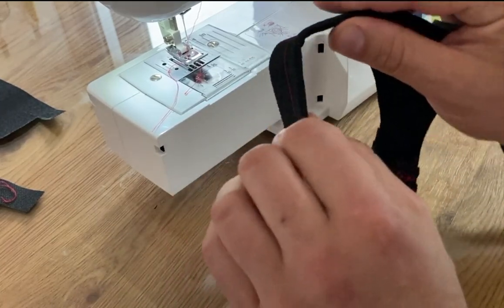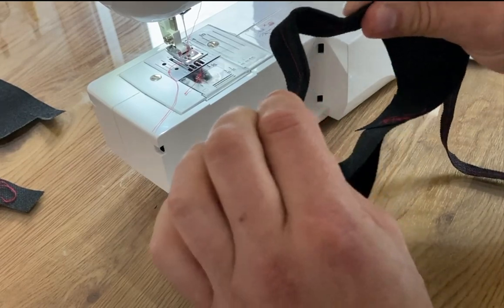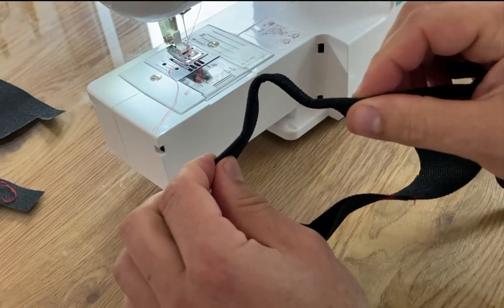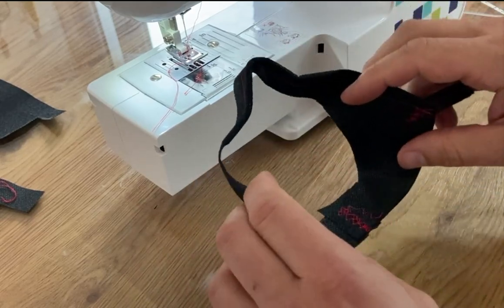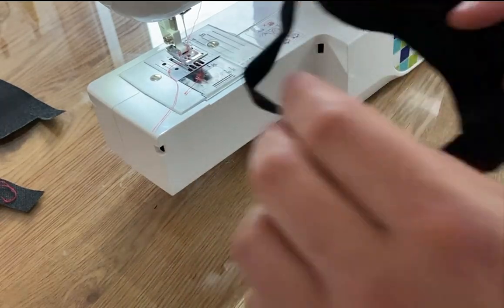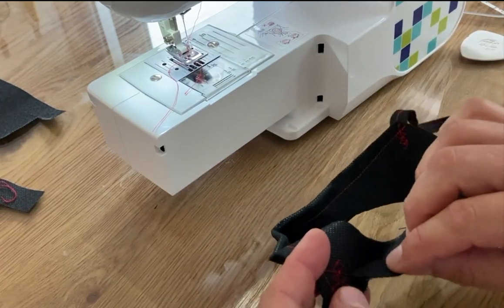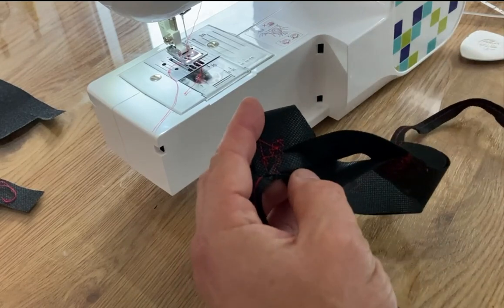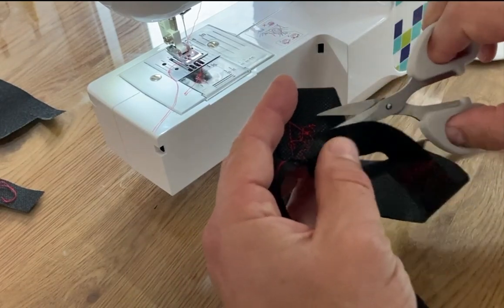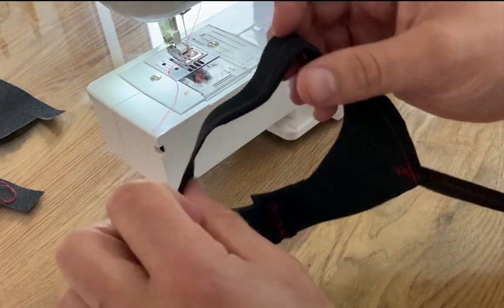You would make a horseshoe shape-ish, you know, that was about 10 centimeters for your nose shape. You put your surgical mask on first, then you put this on your face, then you put your chin on your chest. Oops, that's not particularly good. What I've done there. Oh no, I've sewn it into itself. Okay, never mind, I'll take the thread picker on that one later.